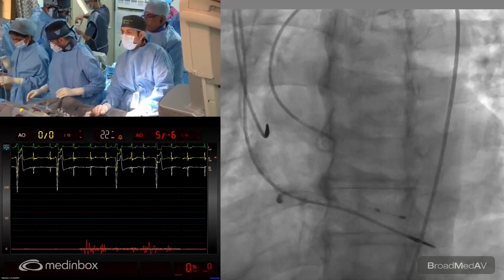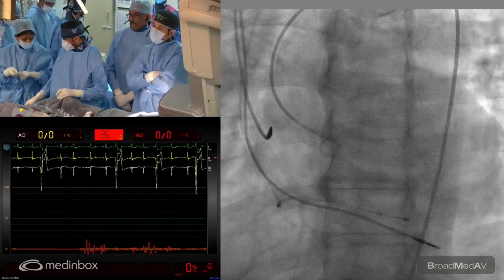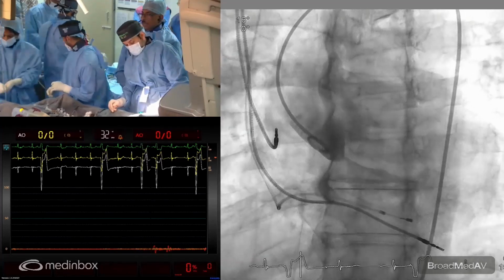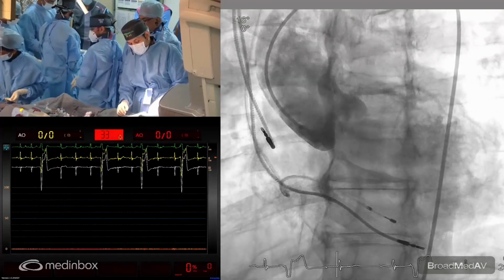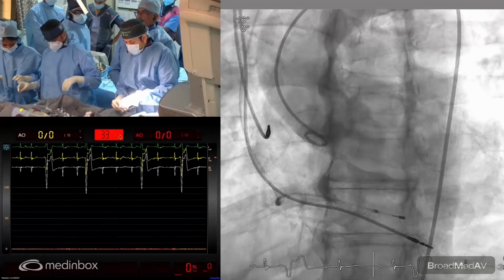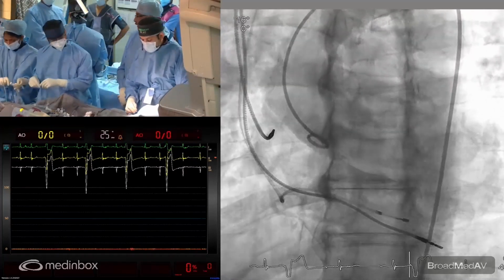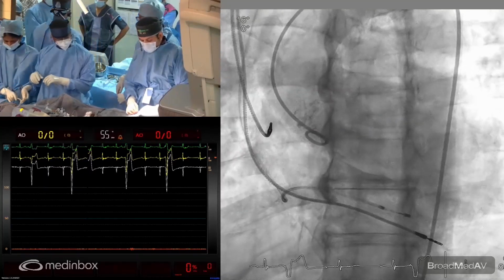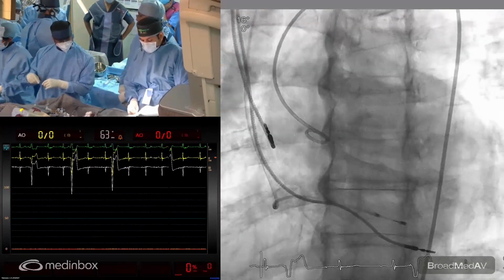Okay. So the aim now is to use an AL1 catheter with a double length wire to cross this valve, and after that we will exchange into a strong wire, and it should be a double length wire, please, sister. So in the meantime, while you are crossing, let me discuss the coronary alignment. Nanda will discuss the valve. If we can see the valve from the camera, I'm not sure, but if you can, maybe Nanda, please go to the other side so we don't block the cameras.